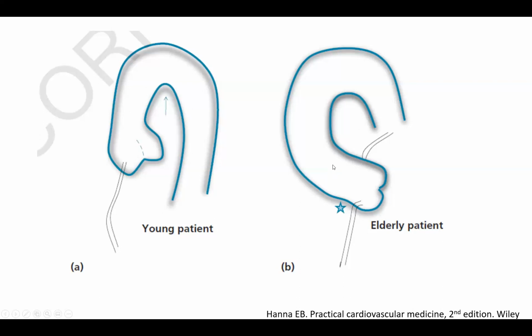When the aorta is elongated, the distance from the aortic valve to the right coronary artery is the same, regardless of the shape, but the vertical level is different. Here, the vertical level of that right coronary artery will be a lot lower than the vertical level of the RCA in this patient. The RCA will seem displaced more downward and is pointing more downward than usual here. And the way you can tell the shape of the aorta is from the shape of your catheter. How the catheter is looking is how the aorta is.